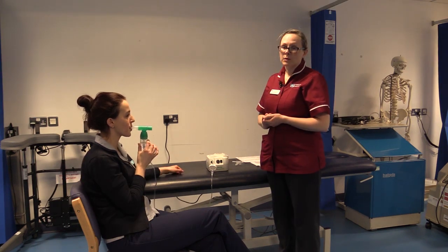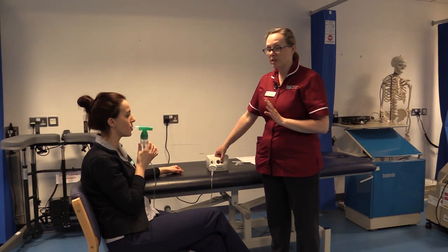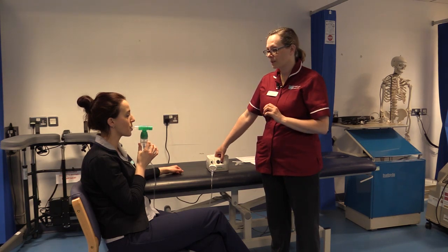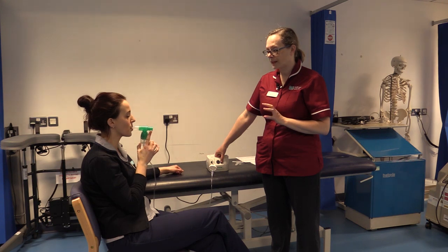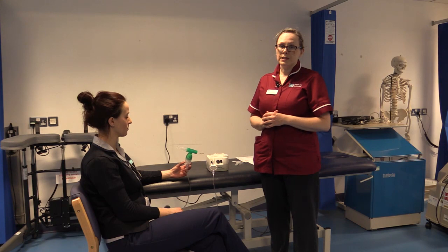The nebuliser will take approximately 5 minutes to complete if there's only 1 ampule in it, and it will sound something like this. When it's finished, it will splutter and you will not see any mist coming from it. Like all procedures before you commence, you will follow appropriate infection control procedures and you will gain consent from your patient.